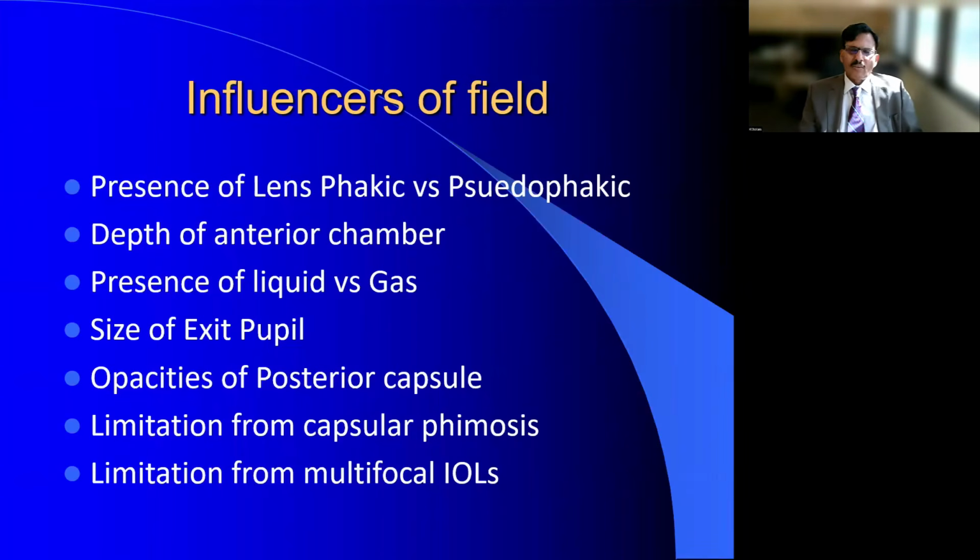One other thing that I should also mention is the phakic lens in diabetics. Sometimes they can get very cloudy. So you have to supplement your infusion fluid with dextrose solution. If somebody is hyperglycemic, like in diabetes, the increased sugar content can suck water into your lens and make it thicker and also cloudier. The dextrose solution desiccates the lens and helps retain the clarity of your lens throughout your surgery.